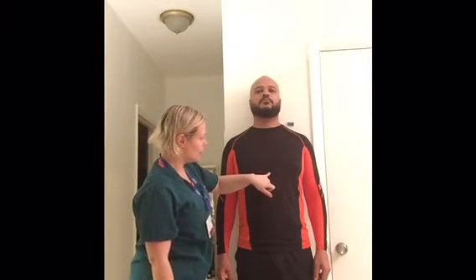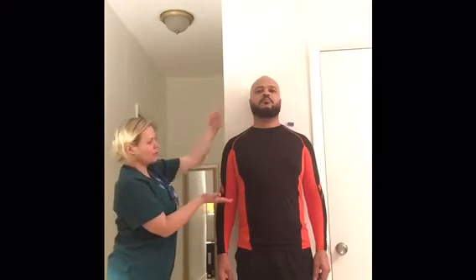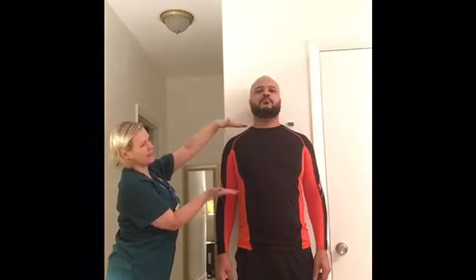And then for the lower ribs, the central ray has to be between the mid-sagittal plane and the xiphoid process. So the mid-sagittal plane and the xiphoid is about here, I would say. Easy: you have your cassette, you first did it about like this.